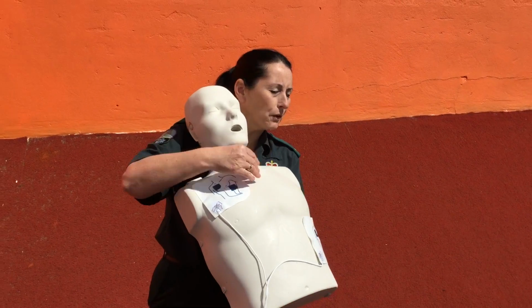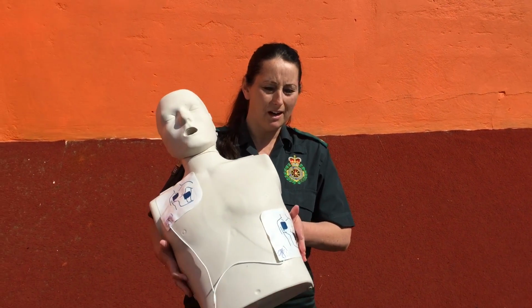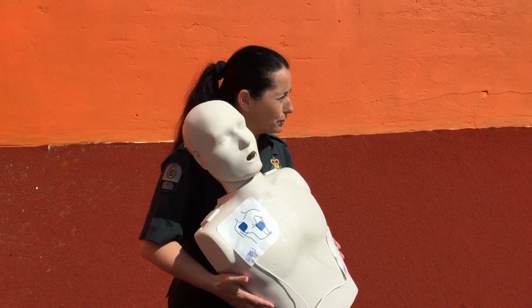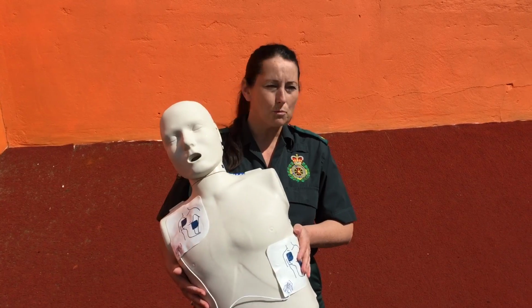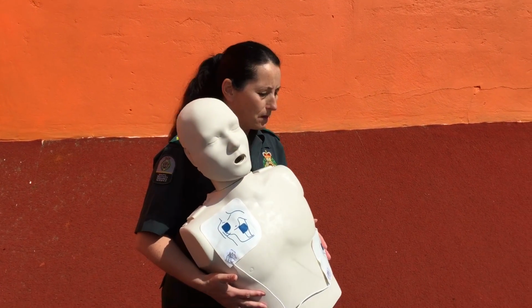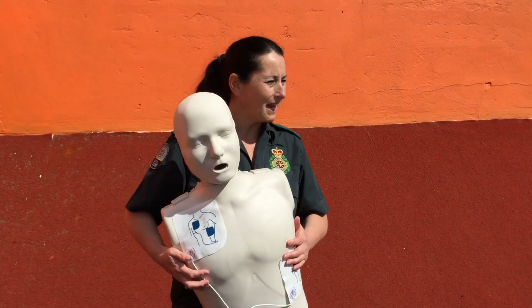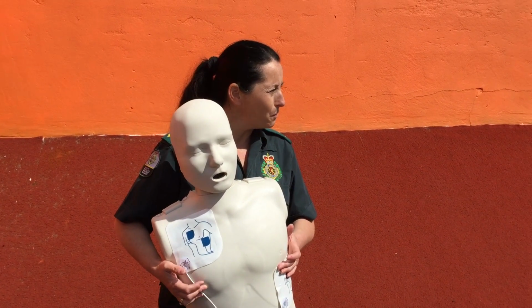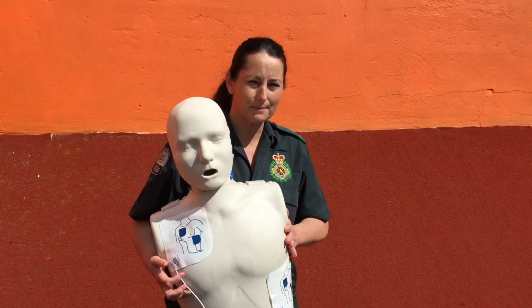The last thing I want to go through is children. They are broken down into different age groups. Any child that is 8 or above, you would class as an adult, so your pads would be sited the same. And how many hands would you use on CPR for an adult? 2. Yeah, absolutely. So 2 hands.